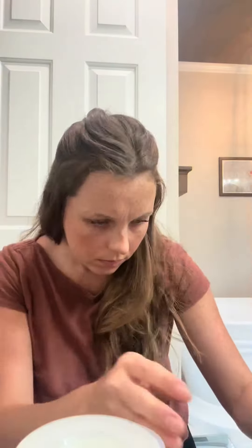Disclaimer — I had not pumped or breastfed since probably midnight last night, so that's why this one is so full. Yeah, there's like a little over 6 ounces in this one.